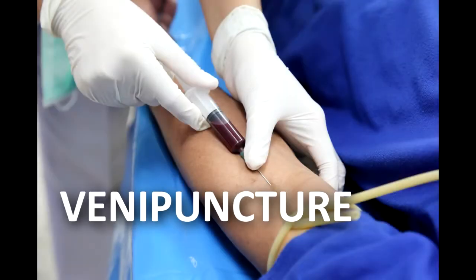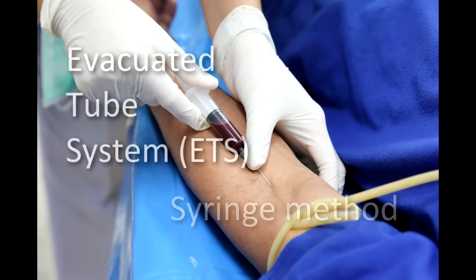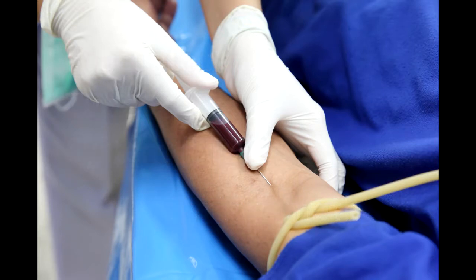Routine venipuncture is the most common blood collection procedure for a phlebotomist. Venipuncture can be performed using two methods, the syringe method and the evacuated tube system, or ETS. The syringe method is often preferred over an evacuated tube when drawing blood from patients with small or fragile veins.